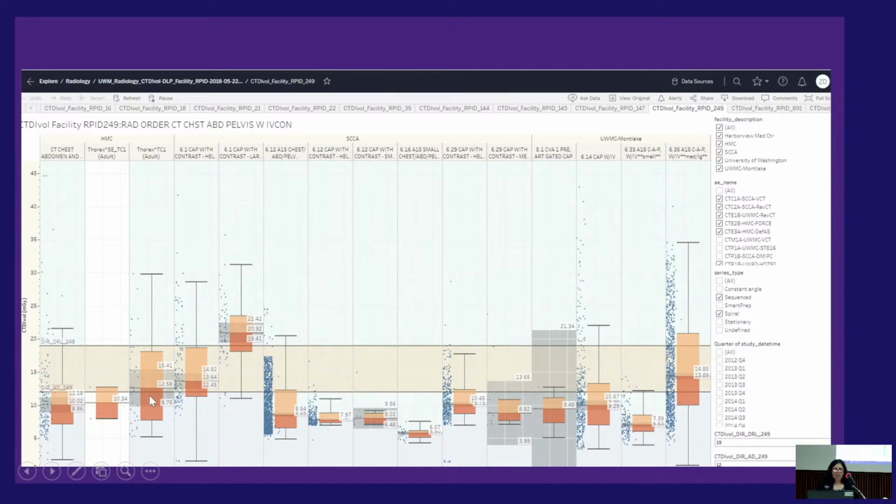And the shaded area here is the achievable dose and the DRL from the ACR Dose Index Registry. So we are not as bad. We are kind of similar to Sam, except in some cases we are higher. But if we are in the range, we will not try to reduce our dose more. We kind of are fine with that. But that's because we are not a pediatric hospital. We get very few peds at University of Washington. All our peds go to Seattle Children's.